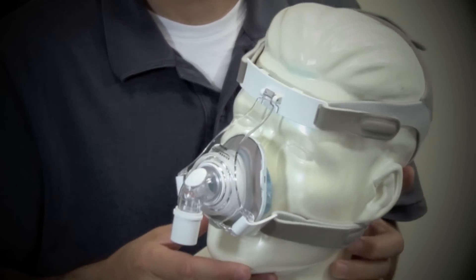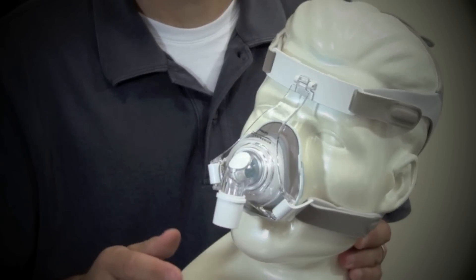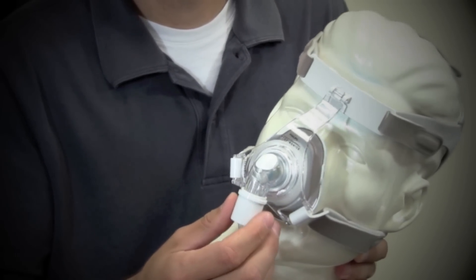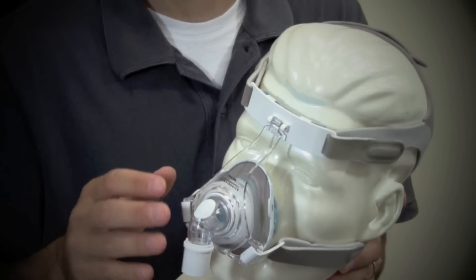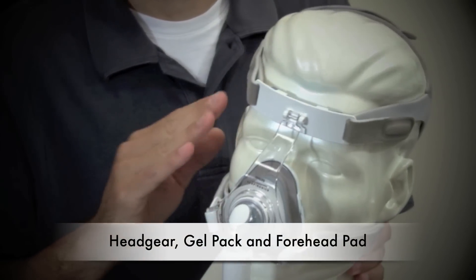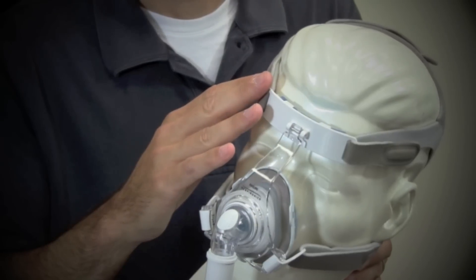Like all Respironics masks, this will work with any CPAP or BiPAP machine. There are no special adapters or connectors needed. A standard CPAP tube will connect right to the elbow. This mask has several replaceable parts which will cut down on long-term expenses — the headgear, the gel, and the forehead pad are all replaceable.